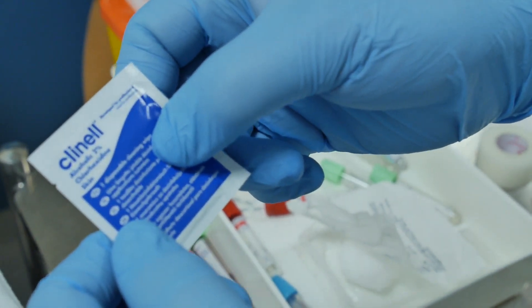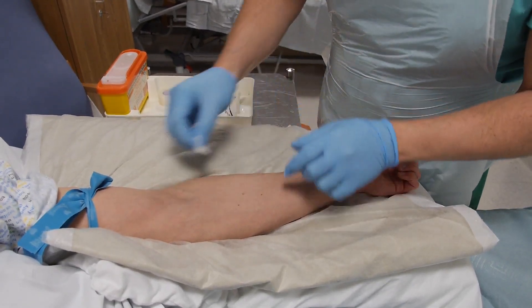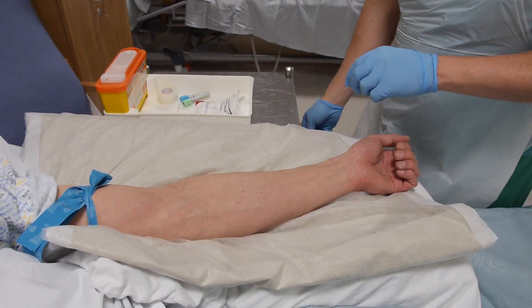Using a chlorhexidine containing alcohol wipe, clean the patient's skin for approximately 30 seconds. Do not re-palpate or touch the skin after this.